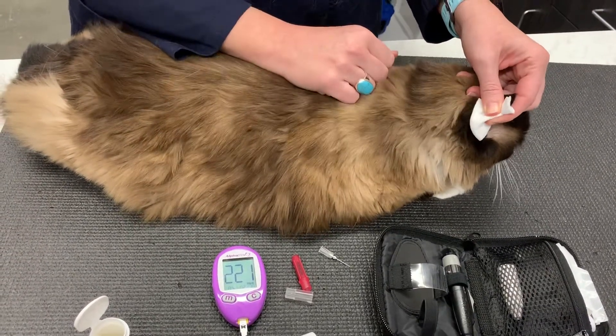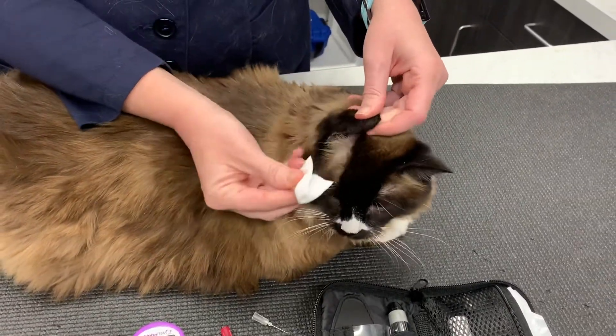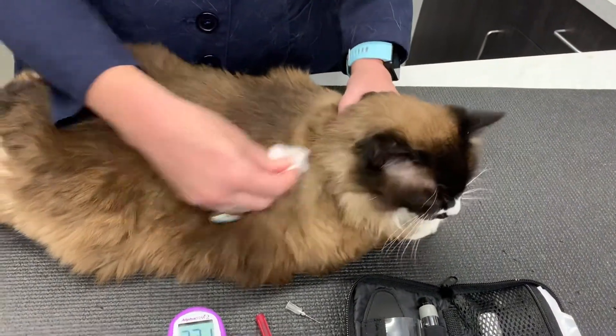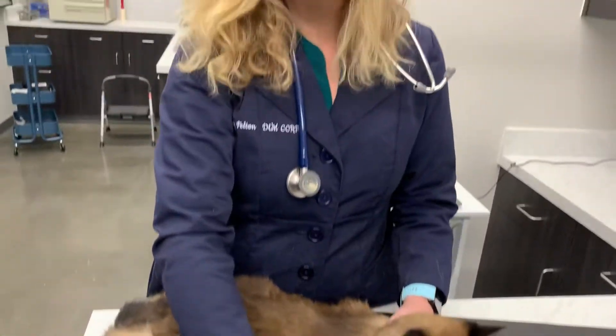I just take a little piece of gauze onto her ear and give a little bit of pressure, and that helps it clot and everything looks great. She won't end up with too bad of a bruise there. She did quite well, and that is how you check your cat's blood glucose at home. Thanks, Belle. Thank you.